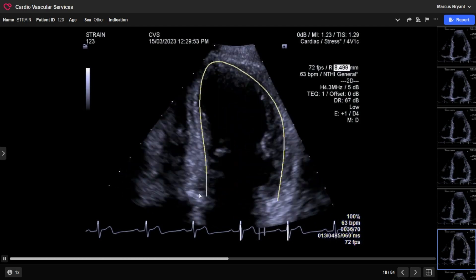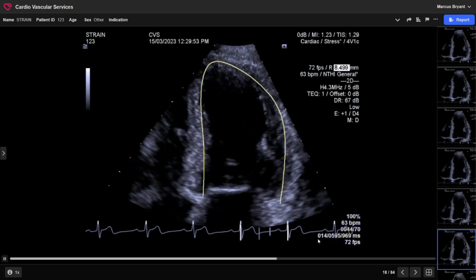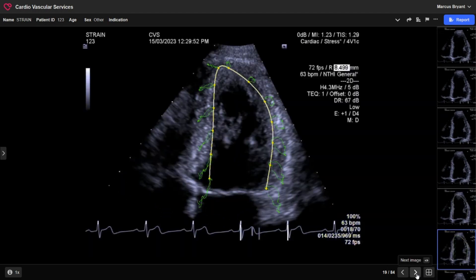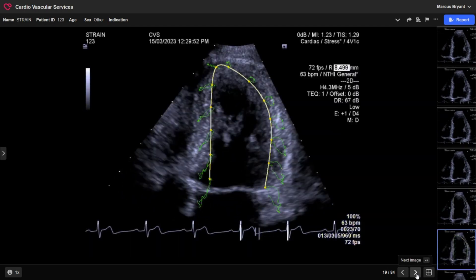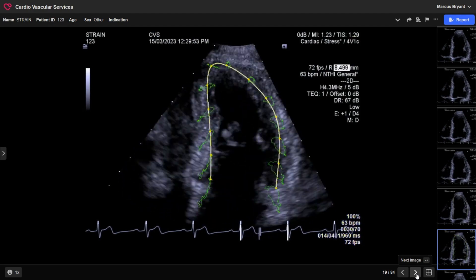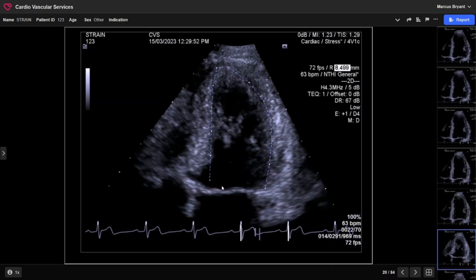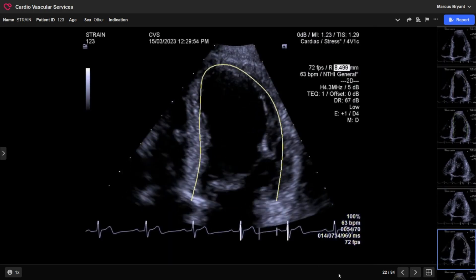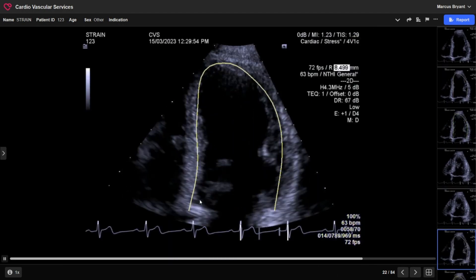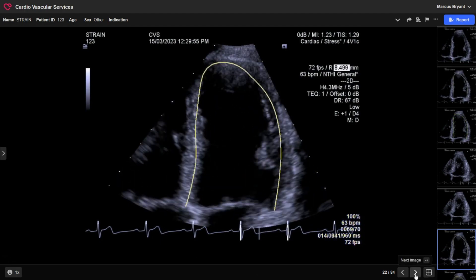When I look at it, I look particularly at the basal point over here and think it's fine there but then it suddenly disappears, and this one could also be a bit better laterally. I'll also watch it with the vector velocities on, which is often my preferred means of viewing. I find that point is the main problem, so I then look at repositioning it - I sort of drag it down and see how that runs in comparison. It could have been tweaked further, but for the sake of this demonstration I'll take that.